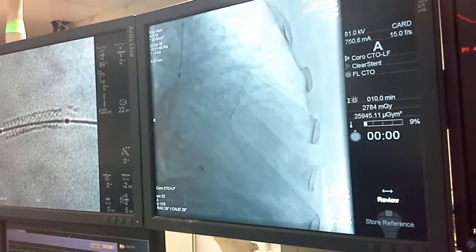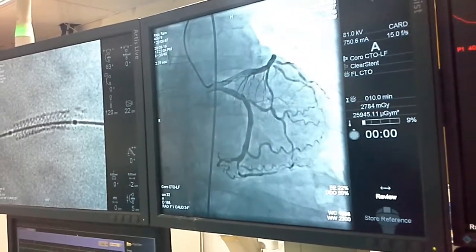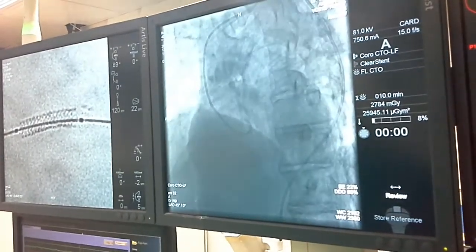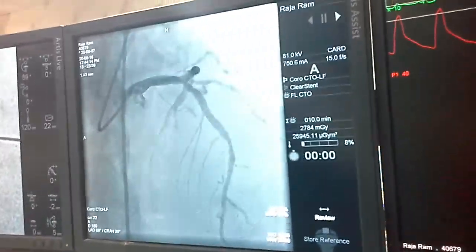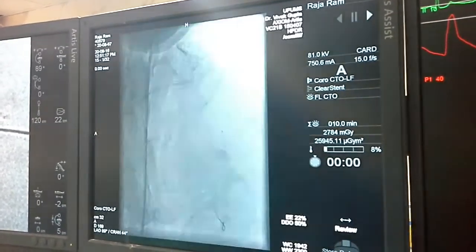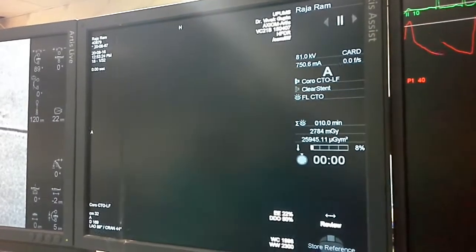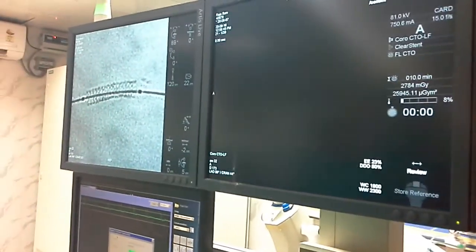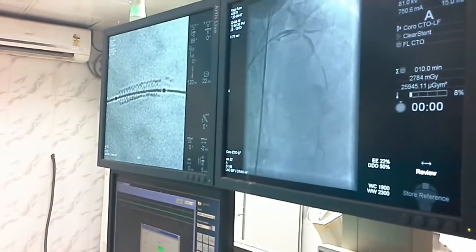Initially we did the stenting of the mid LAD lesion, utilising the Pronova stent. The RCA was non-dominant. So finally we started with the angioplasty procedure of mid LAD — wired with a normal routine wire, pre-dilation with a balloon 1.5 to 10mm, and then we came up with a stent. Post stenting, the result was perfectly alright.